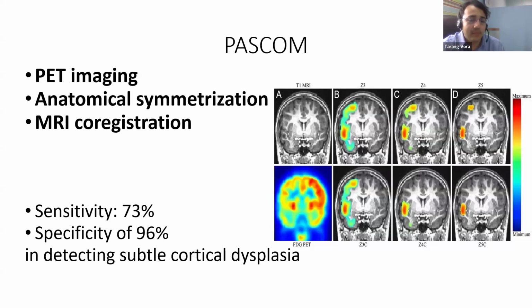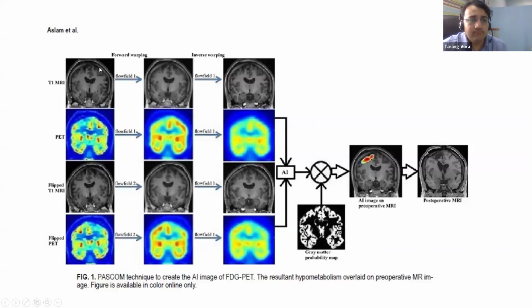This is in case of a focal epilepsy. If it's a diffuse one, then of course PASCOM is going to misguide you. But if you're looking for a focal epilepsy and you know where it is starting from, and the hypometabolism correlates to that area, it gives us, as surgeons, a better judgment as to where we are supposed to look. Of course, the hypometabolism will always have spread along the area where the seizure is passing, but this is an overall view of what they are doing at Amrita, and we are also doing it over here.